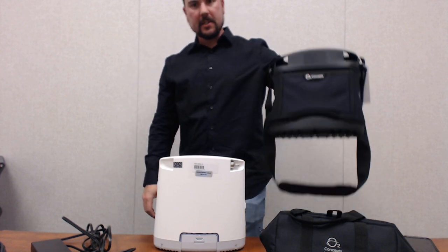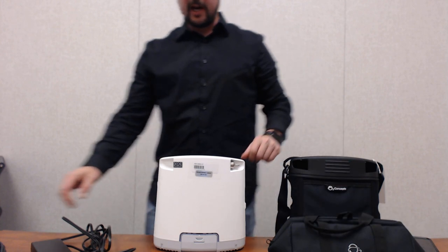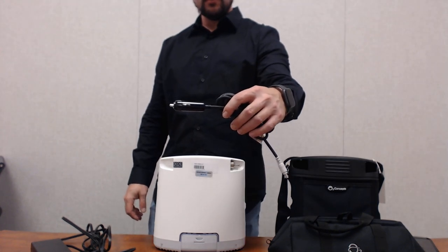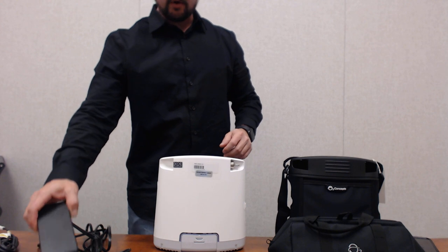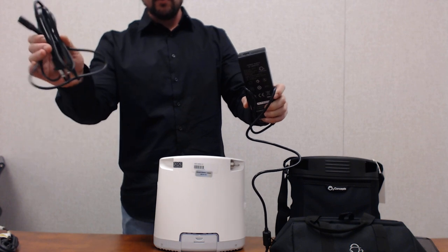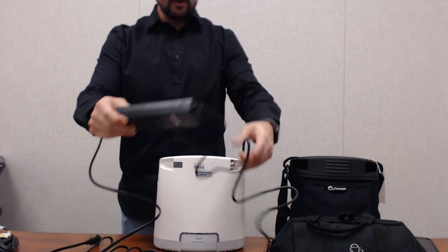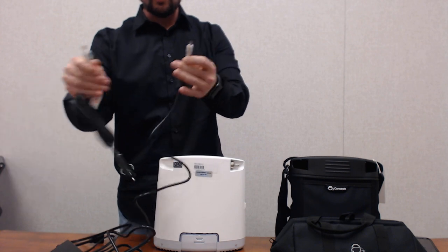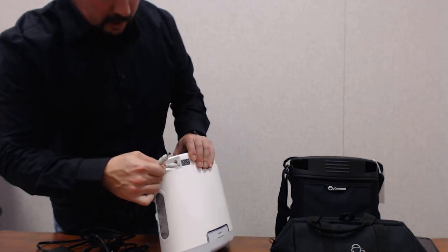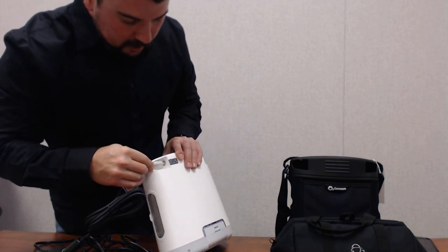We have our carrying case with the shoulder strap, and we have the accessories bag. I have my DC charger — this plugs into the DC outlet in your vehicle. We also have our AC charger, which includes the AC converter box, and a cord that goes to a two-prong outlet; that cord plugs into the converter box. Both the AC charger and the DC charger plug into the same charging port on the device at the top of the unit — just plug straight in.